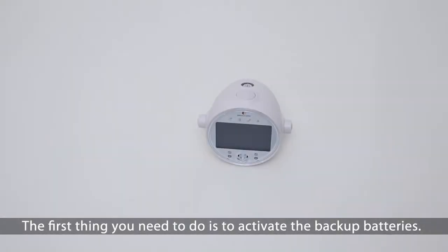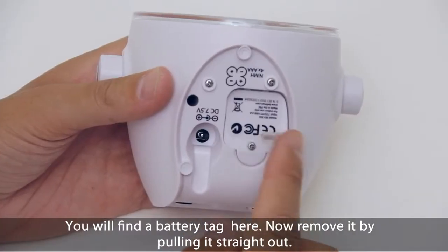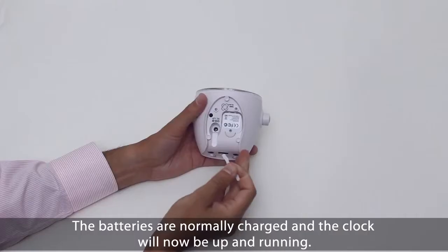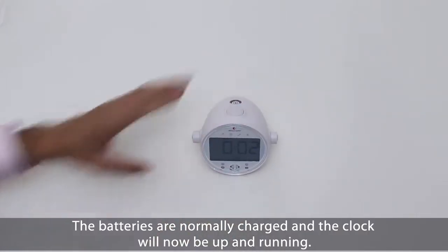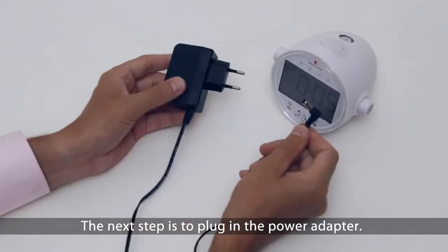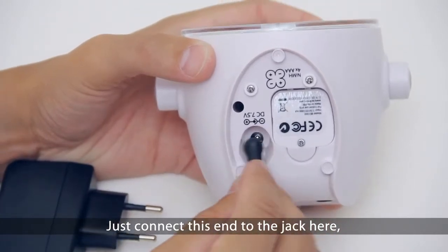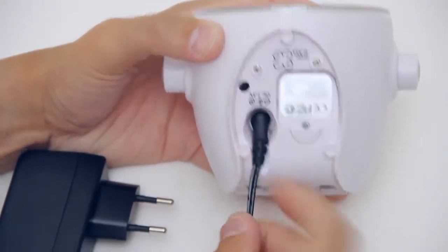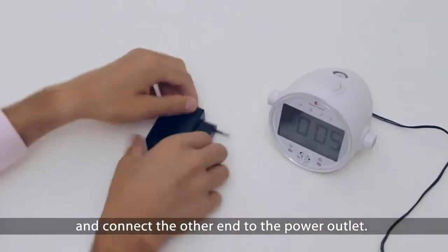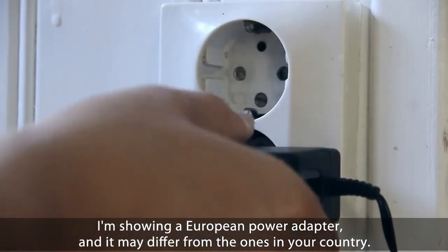The first thing you need to do is to activate the backup batteries. You will find the battery tag here. Now remove it by pulling it straight out. The batteries are normally charged and the clock will now be up and running. The next step is to plug in the power adapter. Just connect this end to the jack here, and connect the other end to the power outlet. I'm showing a European power adapter and it may differ from the one in your country.